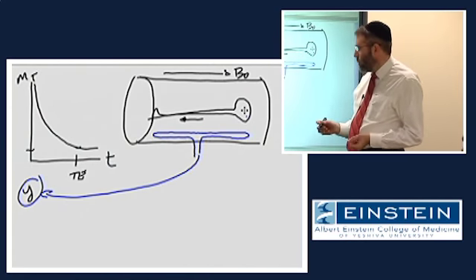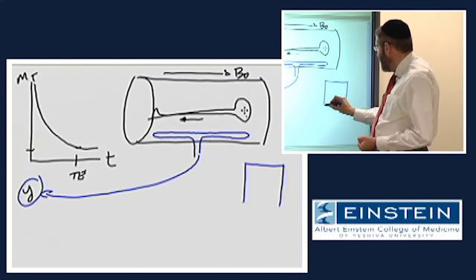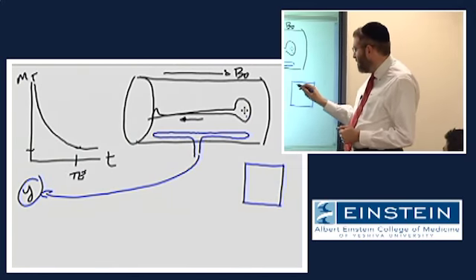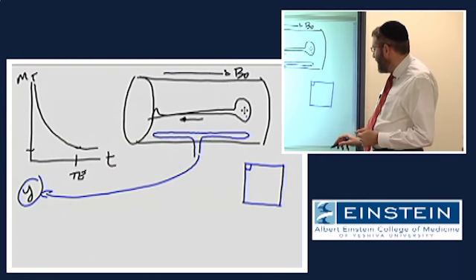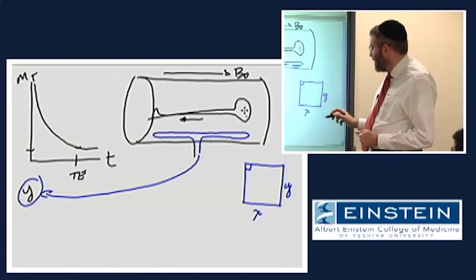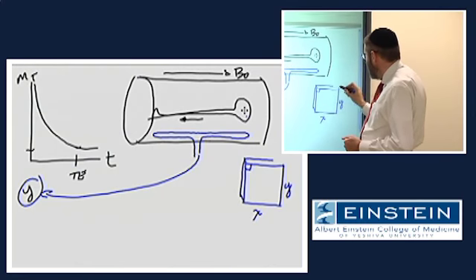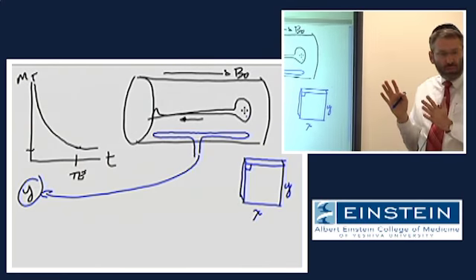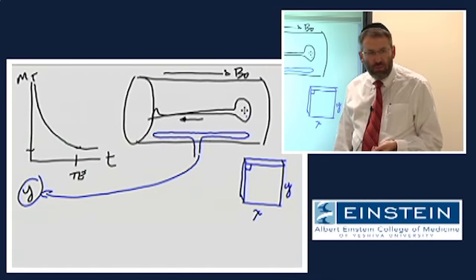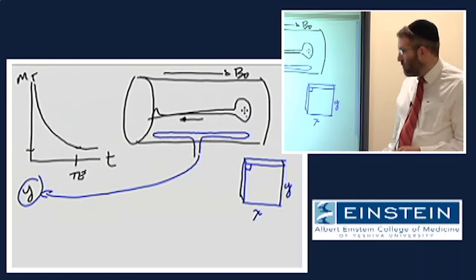The way we're going to go about doing this: most of you are familiar with the fact that when I talk about an image, it is a 2D array of pixels. And we can talk about it as having x and y dimensions. But the images also, as we'll see, actually have some thickness. So even when you look at your CAT scan or your ultrasound or whatever it is, it's not some infinitely thin slice. That slice has some thickness to it.